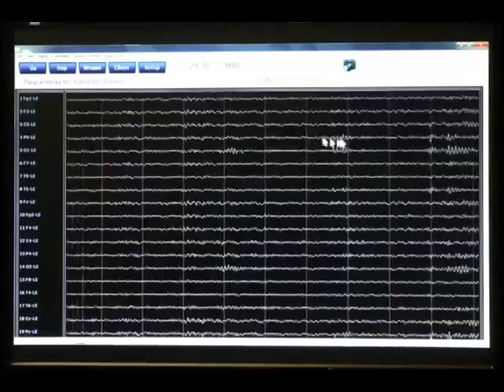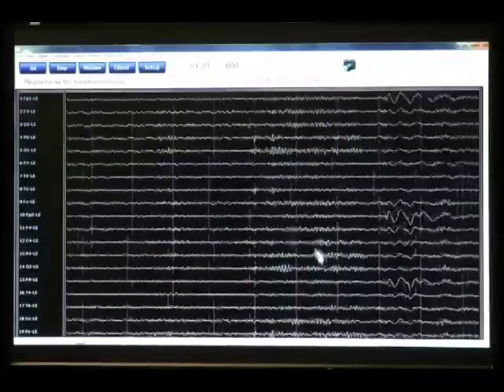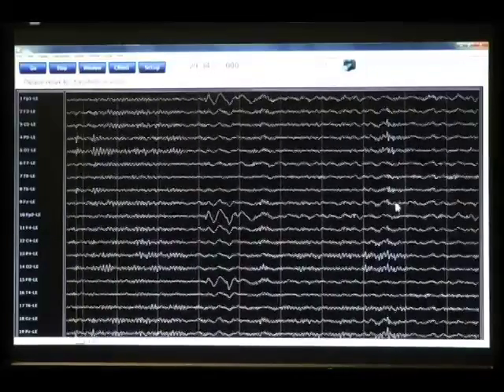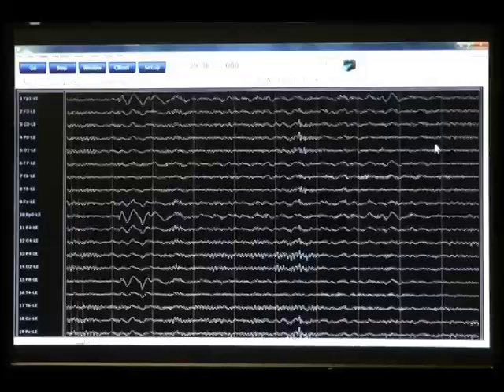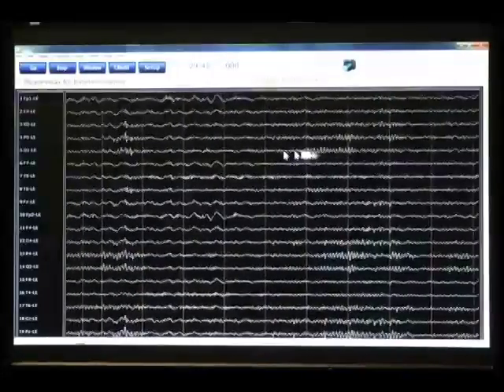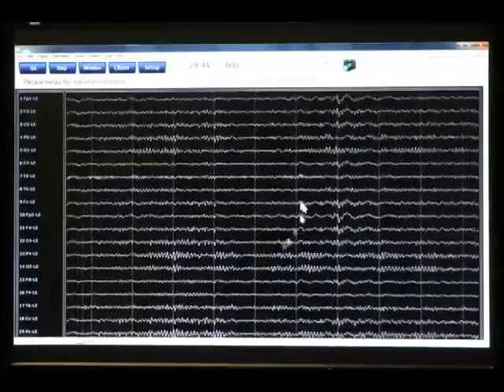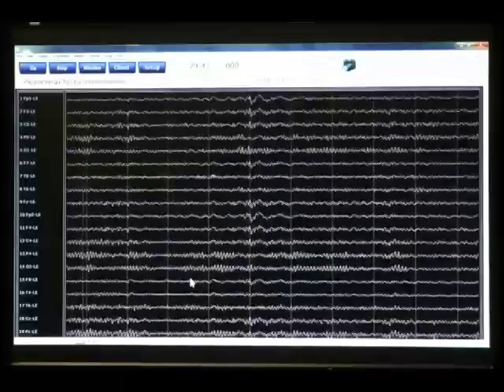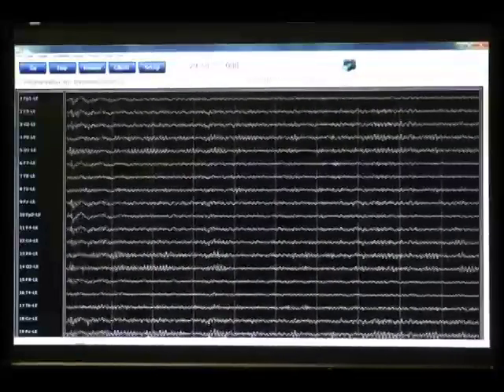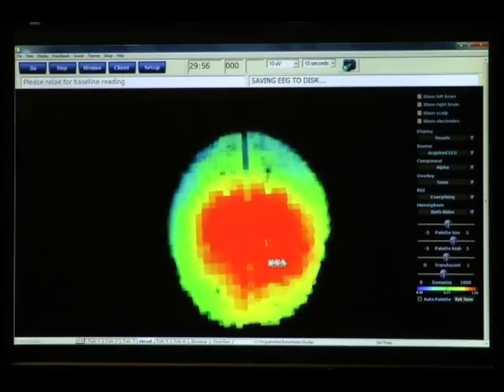But what we're trying to pay attention to here is that as we see these distributions and fields of EEG activity, we'd like to know what's happening inside the brain to produce this type of activity. And Loretta is a technology which allows us to get beneath these types of waves and visualize how they would be appearing inside the brain. So we'll switch from this raw surface waveform screen to the live Loretta projection screen.